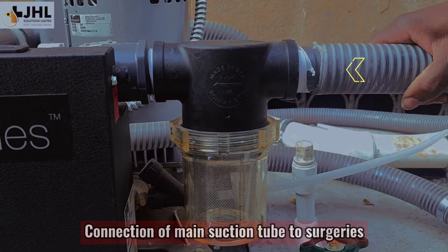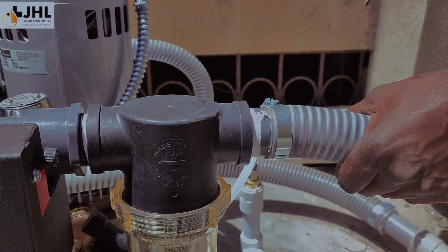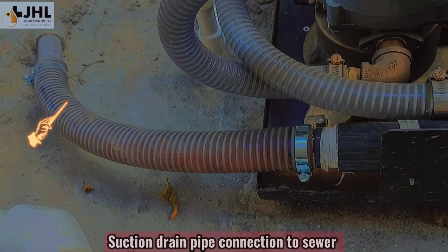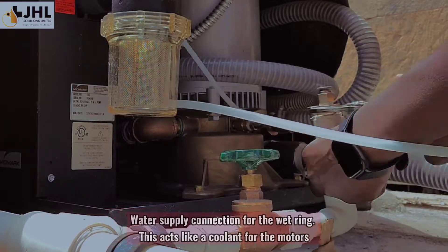Connection of main suction tube to surgeries. Connection of the main vacuum pipe to surgery. Suction drain pipe connection to sewer. Water supply connection for the wet ring.